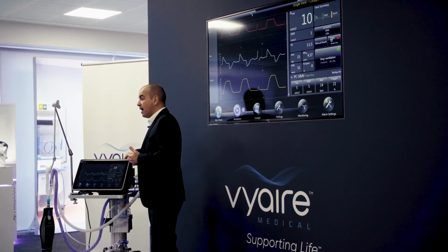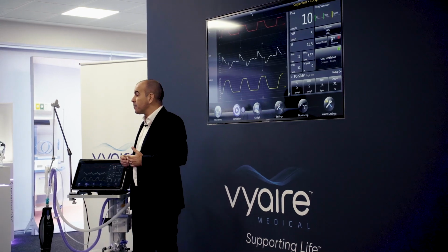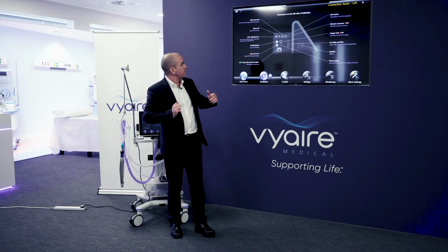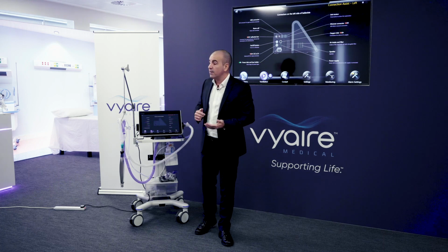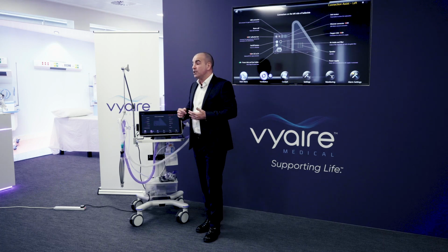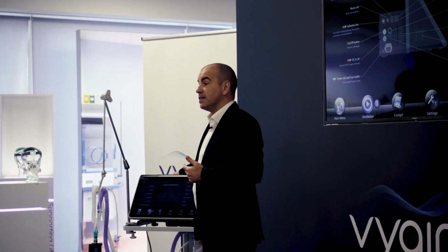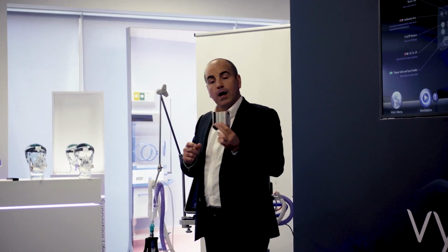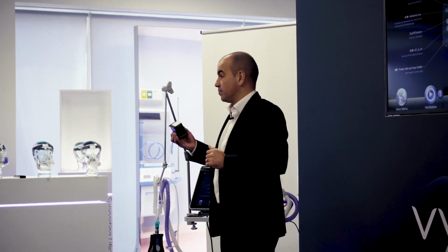So inside we have a turbine, and that runs up to 260 litres of flow per minute. And on the side, you'll notice, if I just pop this up here, we have only an inlet for oxygen. We don't need compressed air, which saves cost and resources for the hospital. We entrain air in from the ambient atmosphere, and then that's mixed with the oxygen inside the turbine. The patient and the device is protected from the air that's entrained in from the ambient. We can have an option of a HEPA filter, so you can protect patient and the device going forward.